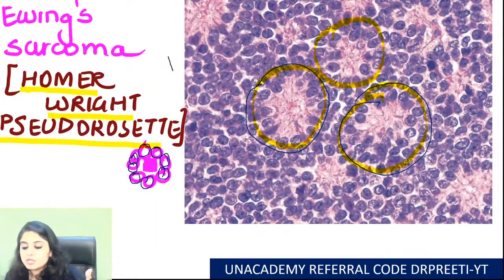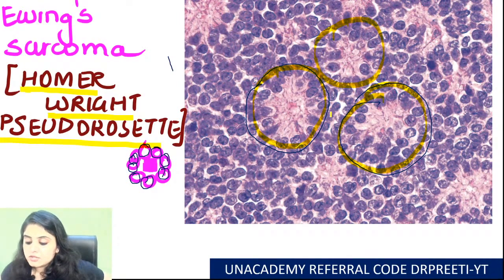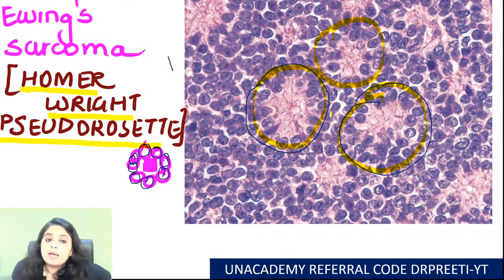Very good, Dr. Sharmila. We've got number 1, medulloblastoma. Then you've got Ewing sarcoma as 2nd. Neuroblastoma also shows you Homer-Wright pseudo-rosettes. And excellent, Dr. Mubarak Ali says, ma'am, retinoblastoma also shows. Okay, now I agree with you. Retinoblastoma can show you Homer-Wright pseudo-rosettes.